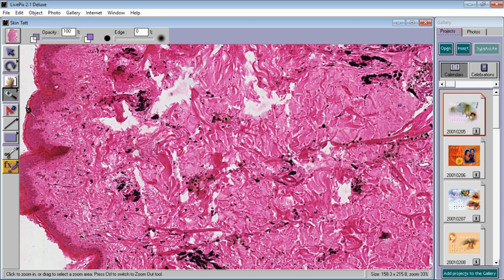Oh, so you can see epidermis, it's keratinized. And then you see these black little things in the dermis. Like there, like there, like there. All these black little particles within the dermis. Let's blow it up and try to figure out what it is.